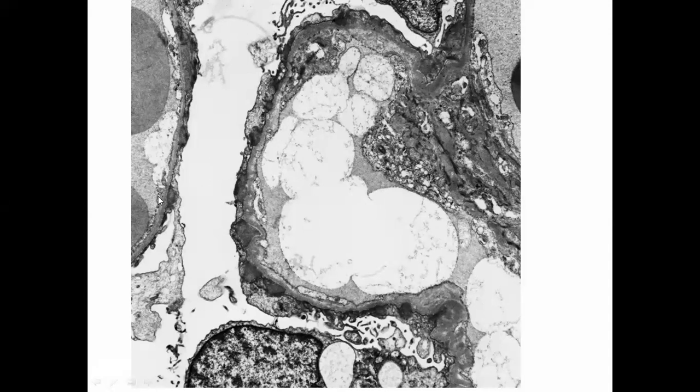And look at this glomerular capillary, the GBM also, and another glomerular capillary loop. You can see deposit here, deposit here, deposit here. If you see subepithelial immune complex like electron dense deposits, that is consistent with membranous glomerulonephritis. The other thing you look for is whether there are deposits in the mesangium. No, there are no deposits.